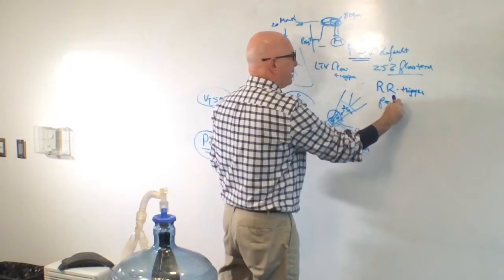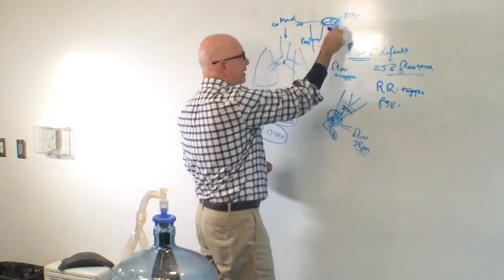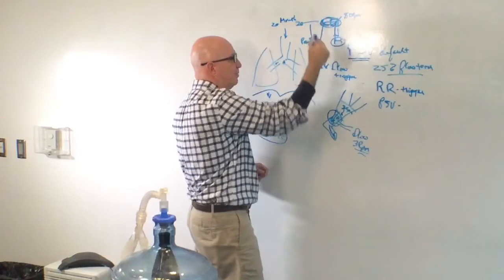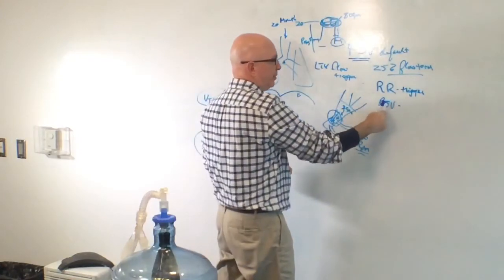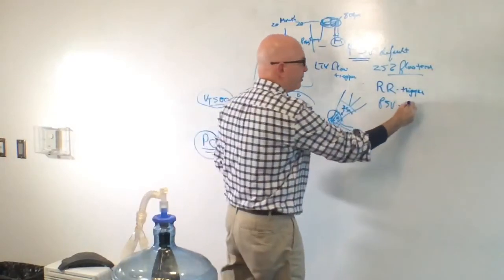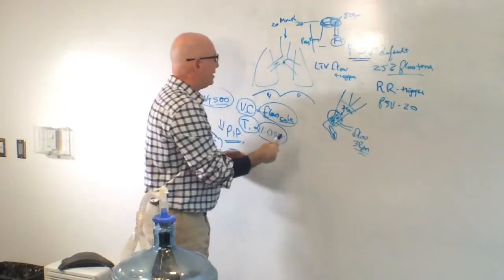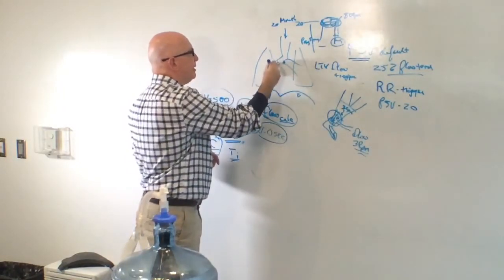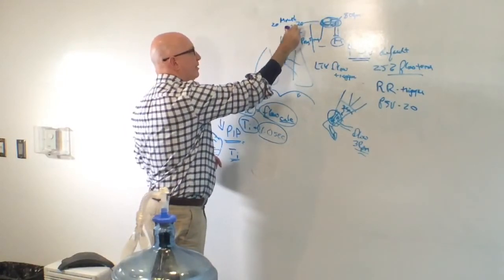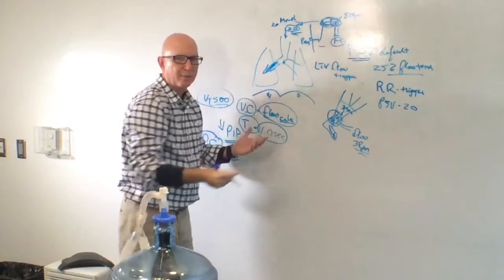Because we're in pressure support breaths, they can tailor the flow that's being generated in this portion as well too, because the machine's goal is to make sure that the pressure in the circuit is equal to your pressure supported breath. So let's say your pressure is 20. If the patient becomes more aggressive in inspiration, then the machine just puts more flow in the circuit to make sure that the pressure in the circuit stays at 20 centimeters of water.